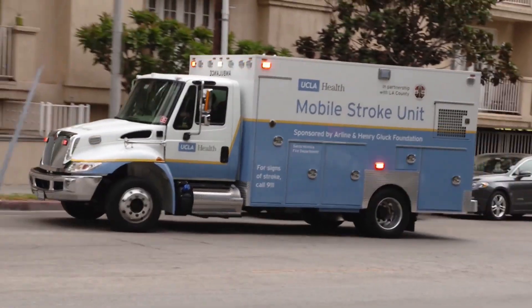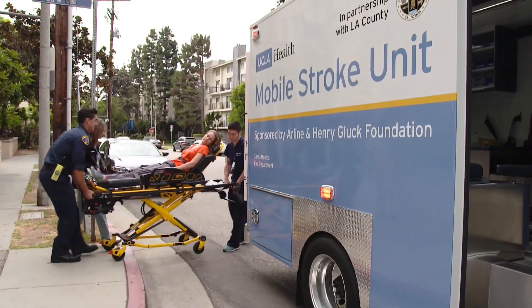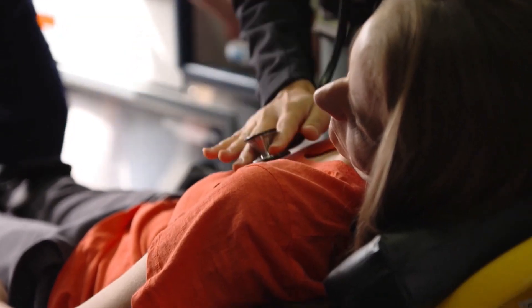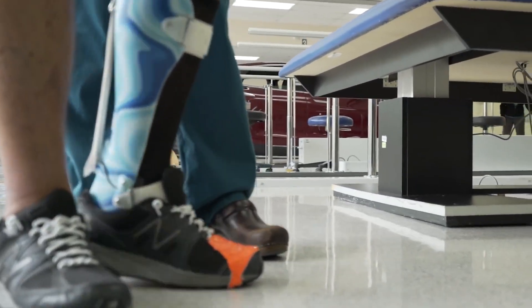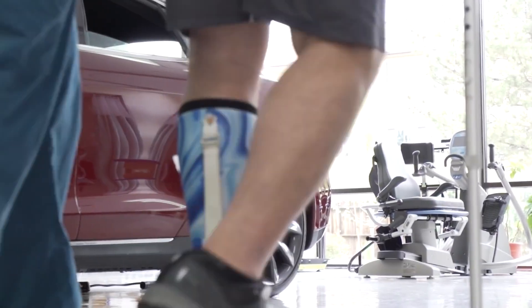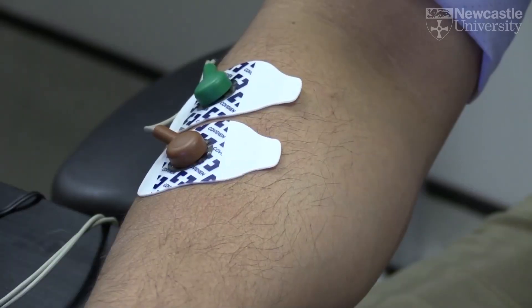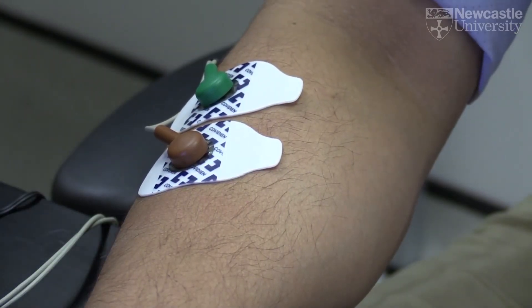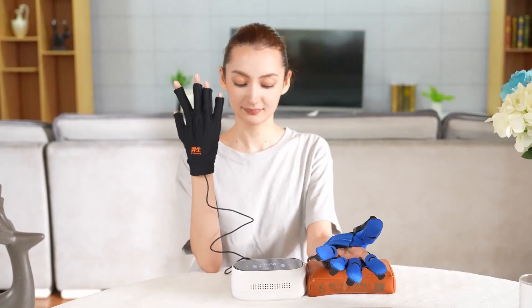Stroke can cause paralysis, weakness, and loss of coordination in the limbs, especially the hands. This can severely affect the quality of life and independence of stroke survivors, who often struggle to perform everyday tasks such as eating, dressing, or writing. To recover their hand function, stroke patients need to undergo intensive and repetitive therapy, which can be costly, time-consuming, and inaccessible for many. That's where the SmartGlove comes in.